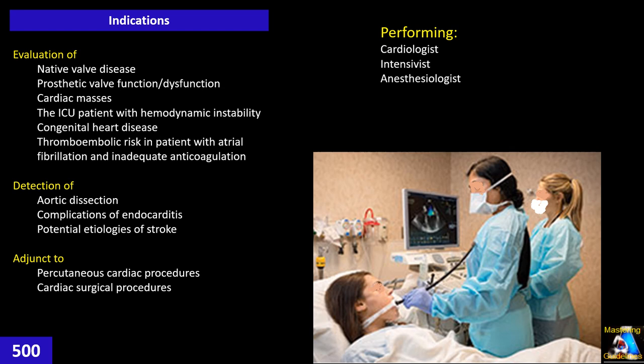For the technique, regarding the performer's position, as a general rule the classic way is that the doctor stands next to the left of the patient. The patient is tilted a little to the left, laterally 10 to 20 degrees, with the head a little up, 30 to 40 degrees, and a little neck flexion. The tech is next to the cardiologist.